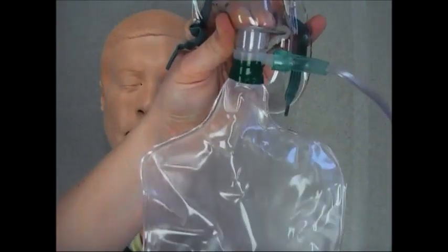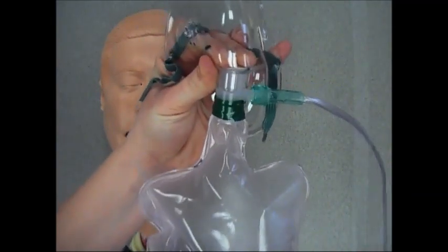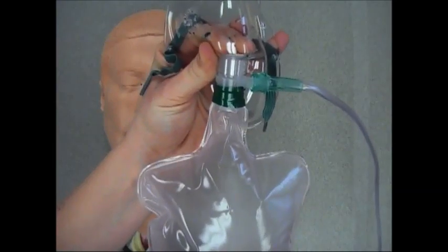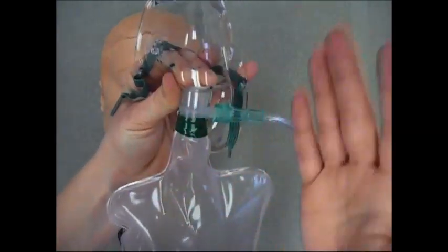So as my bag is filled with oxygen, I can then apply this mask to the patient. You do want to make sure your oxygen is running correctly through the mask. As you see here, the bag is inflated.